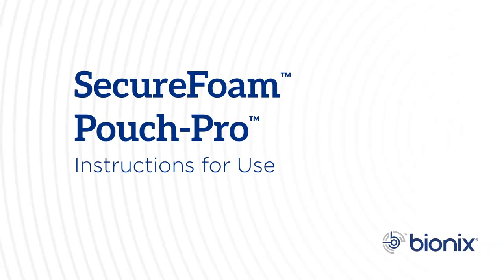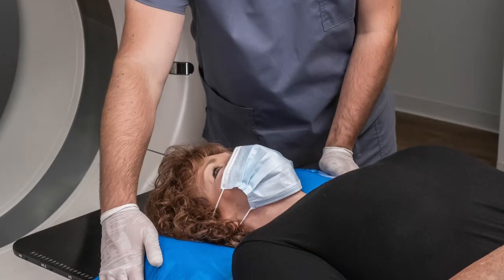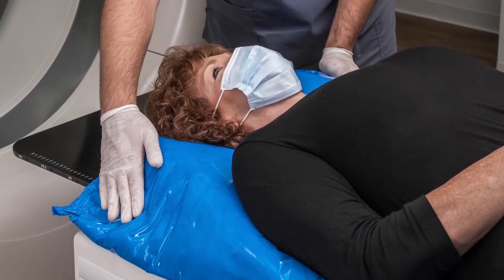With the SecureFoam Pouch Pro, Bionics proudly offers a no-mess, all-in-one solution for custom patient positioning. The SecureFoam activation process is quick and easy. Here's what you need to know.